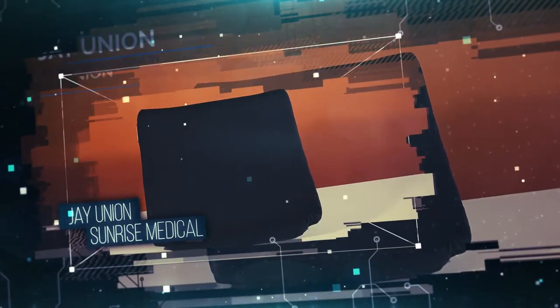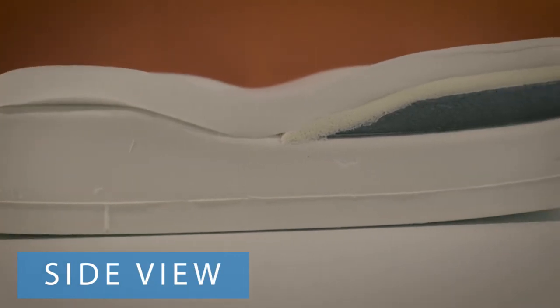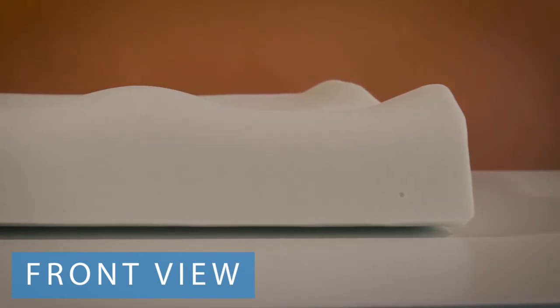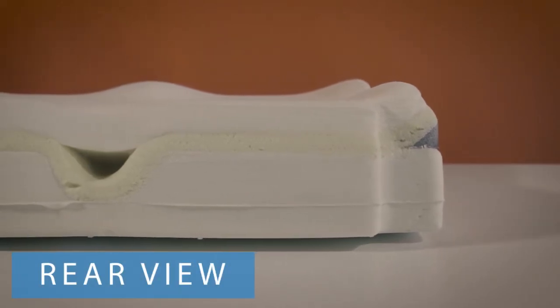Number three on our list takes foam layering technology to the next level. The J Union Wheelchair Cushion from Sunrise Medical combines four layers of foam to create a cushion with a sturdy base, contoured positioning midsection, a super soft low-shear top, and another layer that has a liquid-filled well for supporting your tailbone.